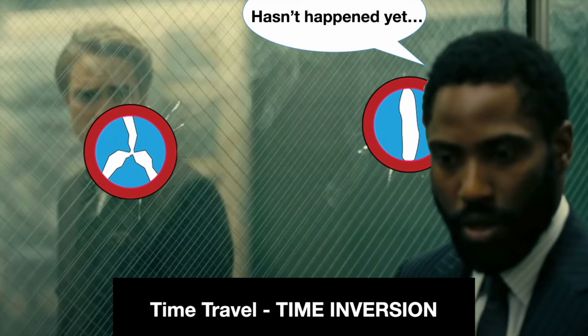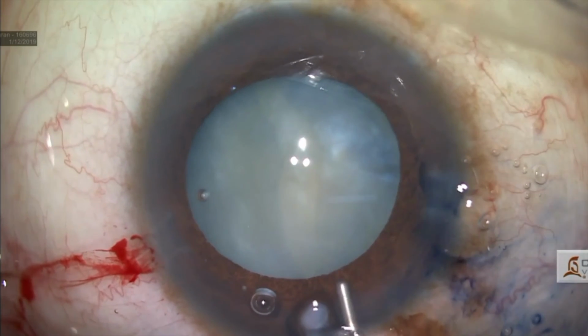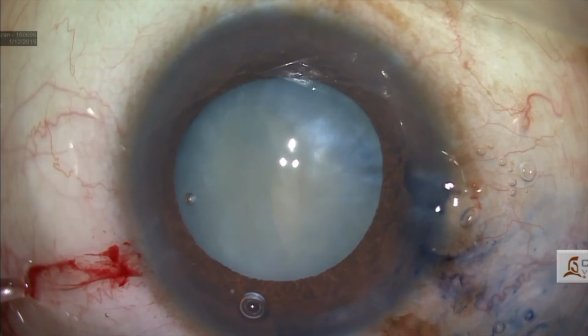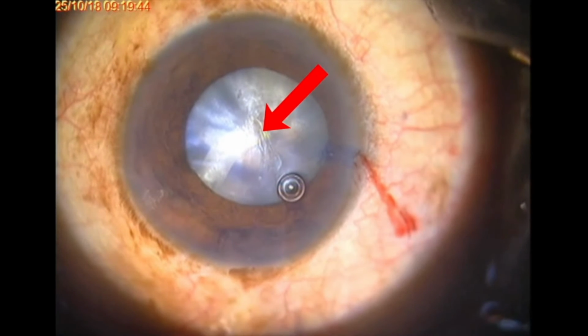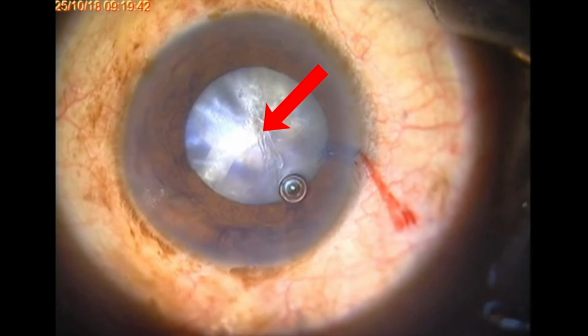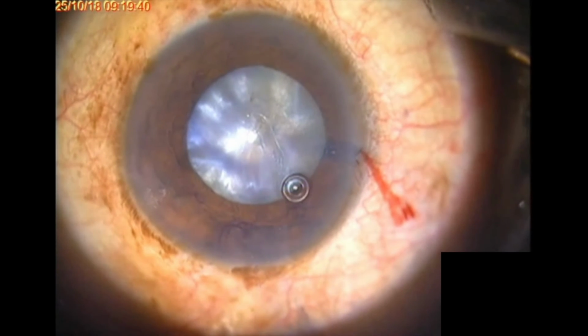Concept of time inversion is something that I would love to propose for the management of Argentinian flag sign. But in reality, we can't really reverse time and prevent it as seen in this video. If only time inversion was that simple to prevent Argentinian flag sign. Because in reality, time travel is not possible. So, prevention is always better than cure. The following points can be kept in the mind of neophytes while encountering and preventing the Argentinian flag sign.